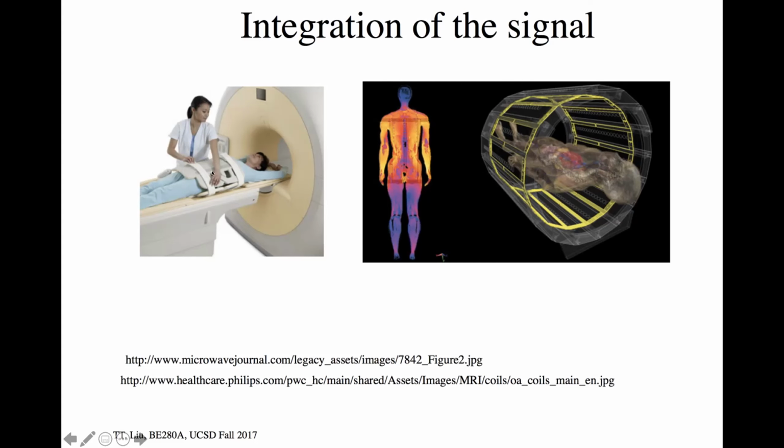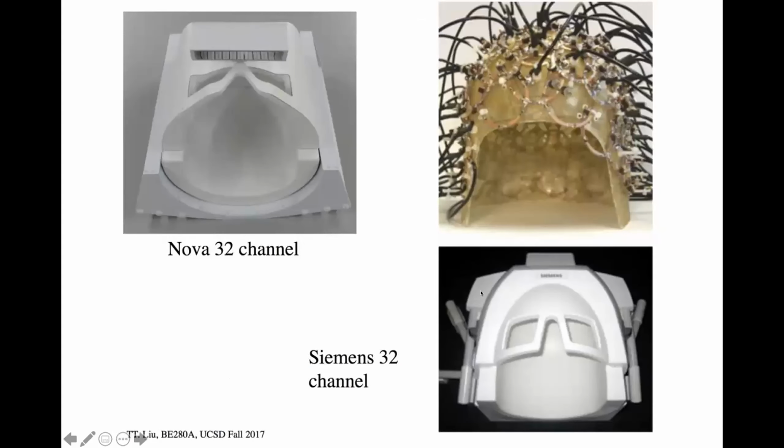And so this adds to the claustrophobia of MR, but it's part of the business that you want to get these receiver coils that receive RF energy from the patient as close as possible to the patient, because their sensitivity drops off with distance away from the patient. So if you can put a coil inside the patient, even better. And so people have invented coils that go inside people. So that's how that's done.